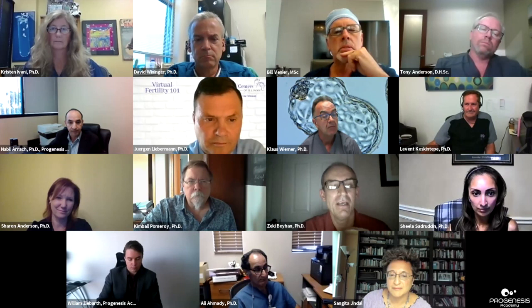As far as this hatching business is concerned, I have another observation and maybe a question for you, Nabil. Especially if you're doing group culture and then hatching on day three, it has happened to me a couple of times, not very often, that when the embryo started to hatch after day three, I end up with hatching blastocysts that are really conjoined together.